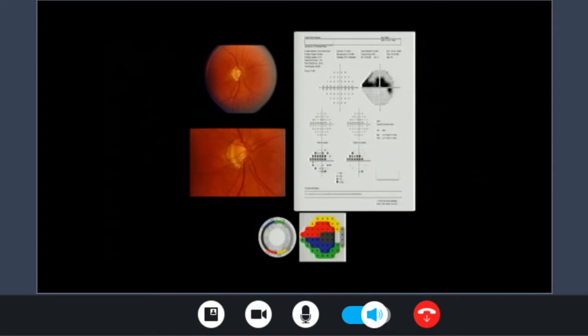Another example here, another visual field printout. As we said before, we'll look at the reliability indices, and before that we will ask ourselves what was done. So we'll go for the W, what was done. What was done is a 24-2 SITA standard, then we'll go for the reliability indices. Zero fixation loss, false positive and false negatives are less than 30%, right? But look at the false negative here, 20%.